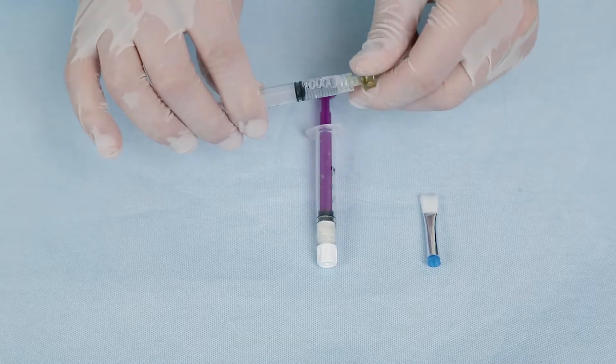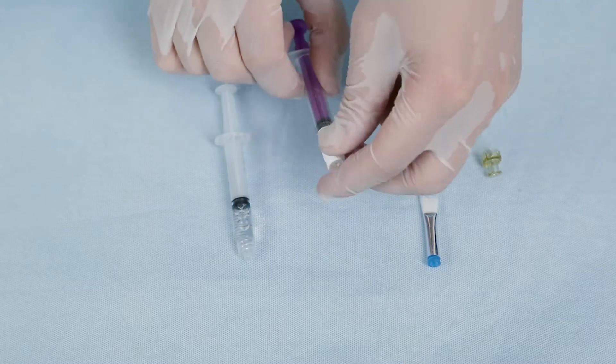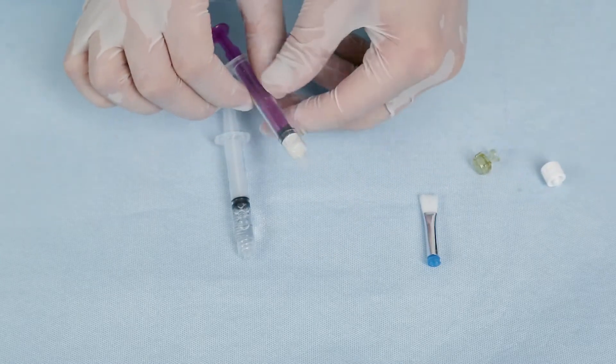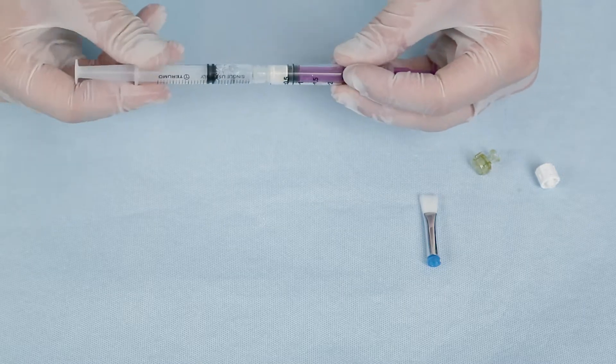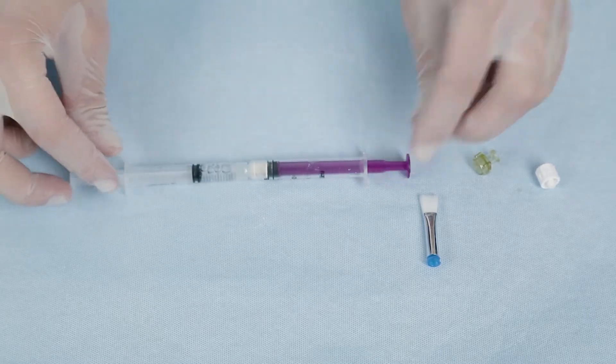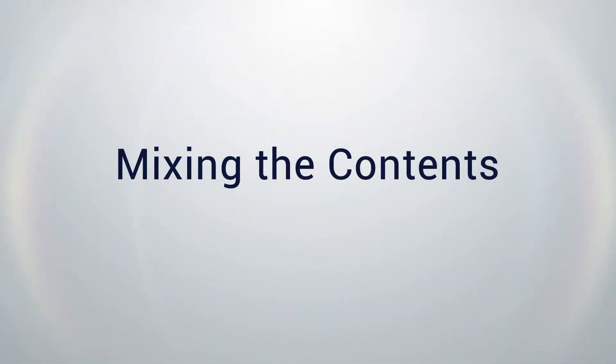Remove the caps from the two syringes and connect them together. Now you are ready for the second step, mixing the contents of the syringes.